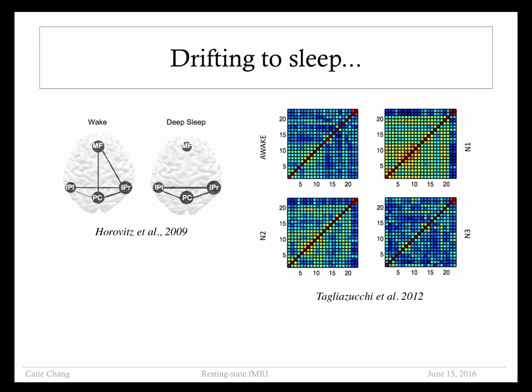And when these authors applied their method to a bunch of resting state scans, when people were supposedly staying awake, they also detected what looked like a lot of sleep in those scans. So this can really change our correlation values, and it can be really important, again, if we expect any systematic differences between groups or subjects, because in resting state analysis the effect sizes usually tend to be pretty small, and so these things can have an impact.